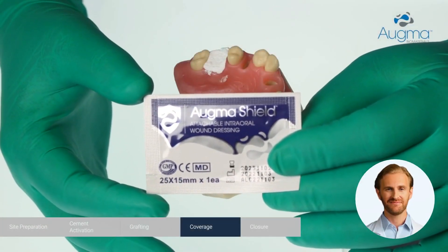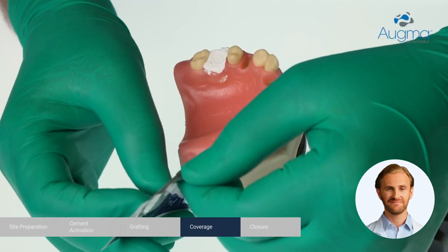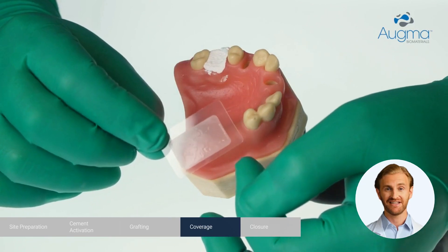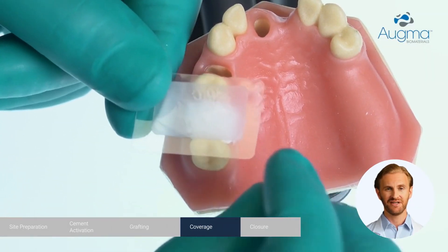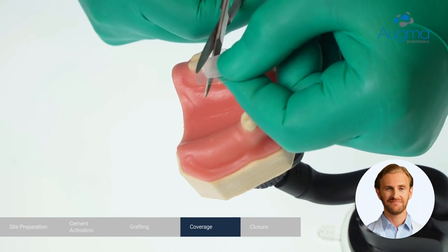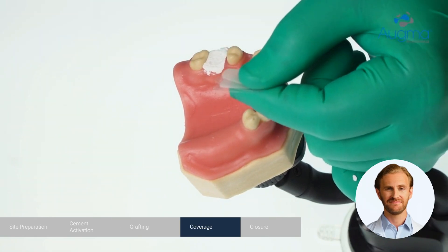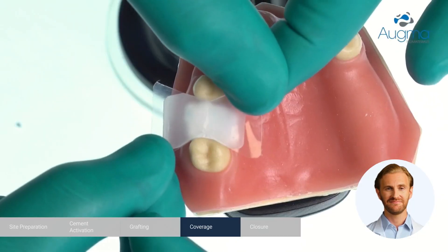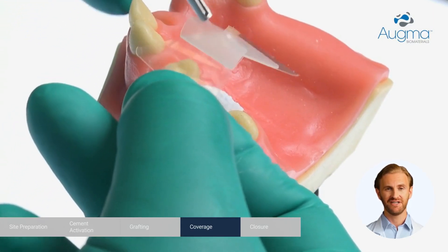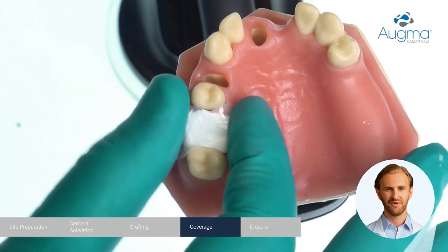Cover the exposed graft with AugmaShield. AugmaShield has a matte layer and a transparent layer. The matte layer is the actual AugmaShield. The side attached to the transparent layer is the side that attaches to the gums. Trim AugmaShield to size so that it fits the defect. Detach the AugmaShield from its under layer and place it on top of the exposed graft, making sure that it covers the entire exposed area and extends 3-4 mm beyond the exposed area from both the buccal and the palatal aspect.